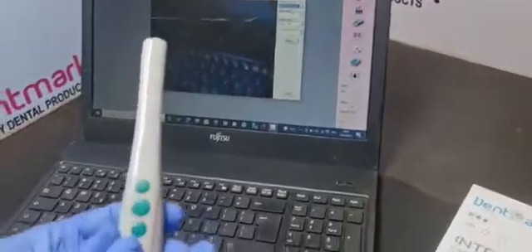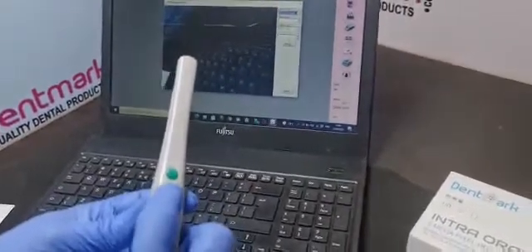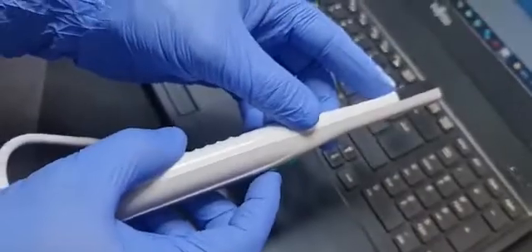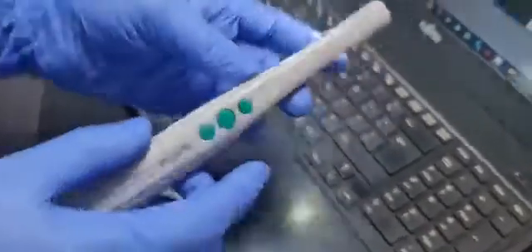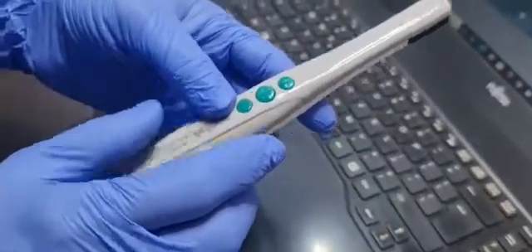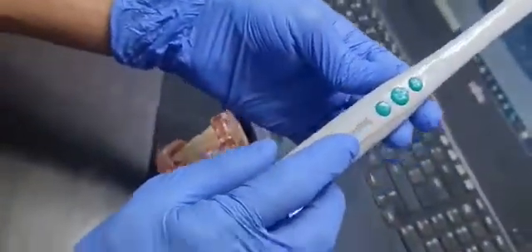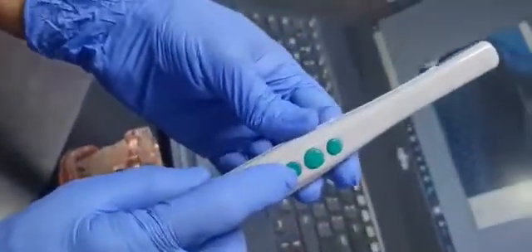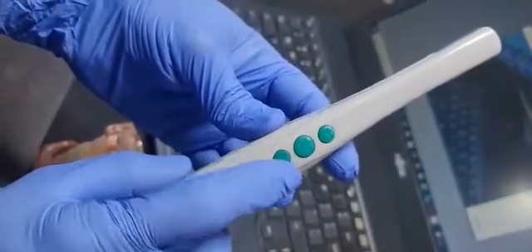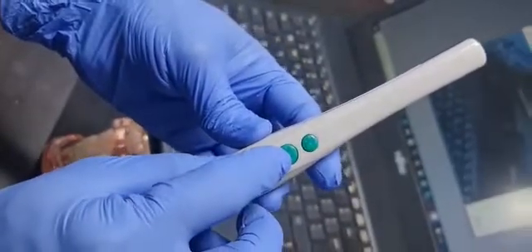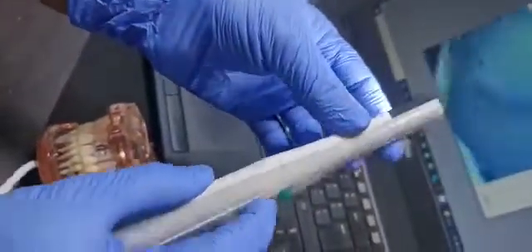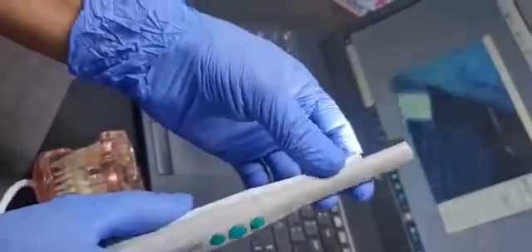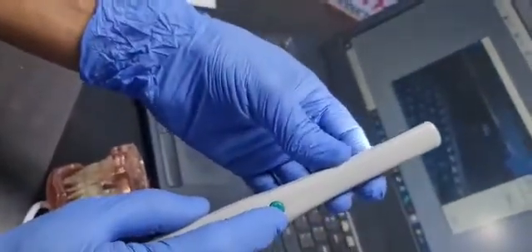So there are three buttons. The center is light on off, you can see. So this dummy button is not working, this is just the design. So this is the power on, the light is coming. If you press for some seconds the light is off. So again you press, light is on. And the first one is capture button.